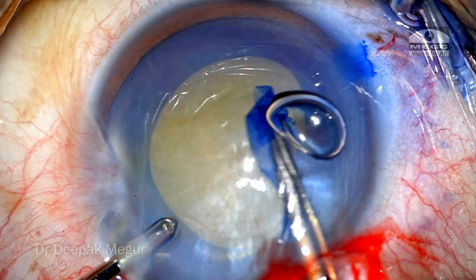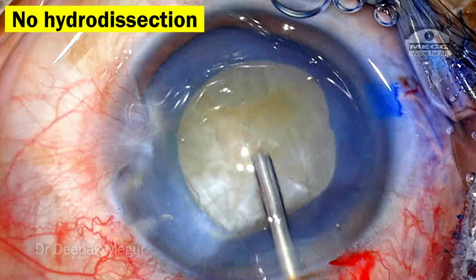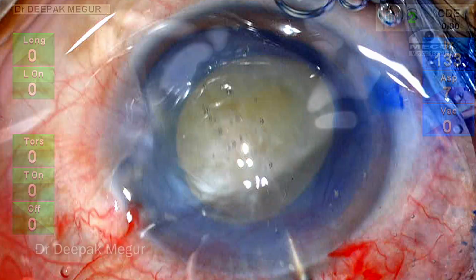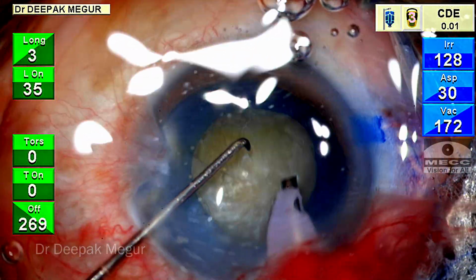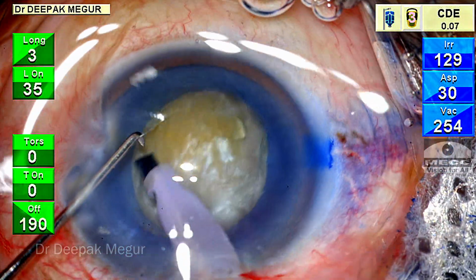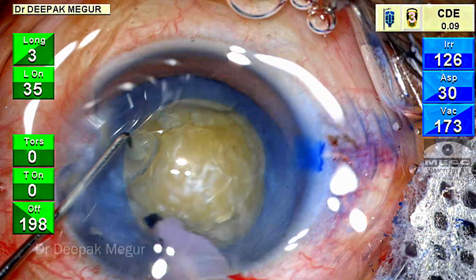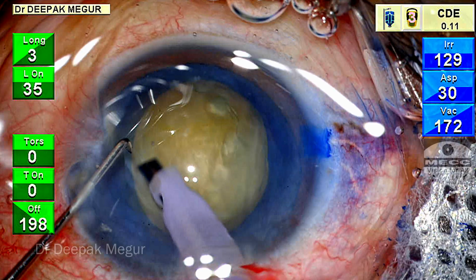The rhexis is done, and it's time to do emulsification of this case. No hydrodissection, as I typically avoid this in all mature cataracts. So time to emulsify the nucleus. The superficial epinucleus is aspirated. There's a lot of pooling of fluid which is happening, and I'm expecting my assistant to help me out with this. He's just connected to the suction machine and trying to clear off the place.